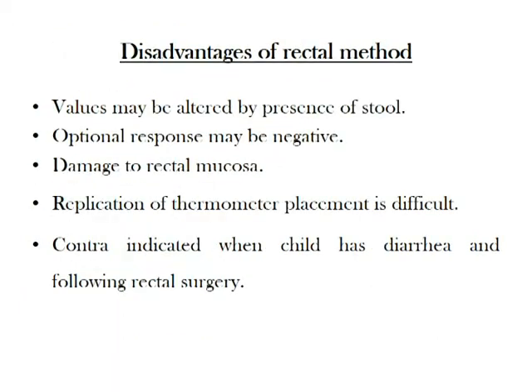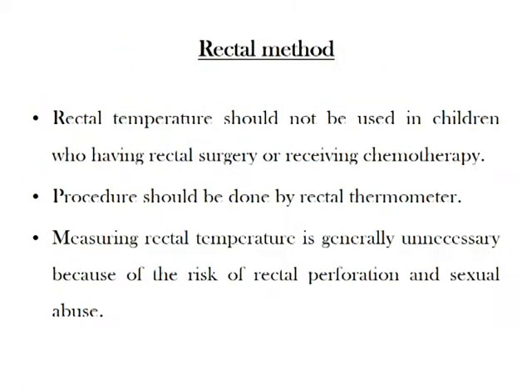Disadvantages of the rectal method: values may be altered by the presence of stool, the child's emotional response may be negative, damage to rectal mucosa, replication of thermometer placement is difficult, and it is contraindicated when the child has diarrhea and following rectal surgery.